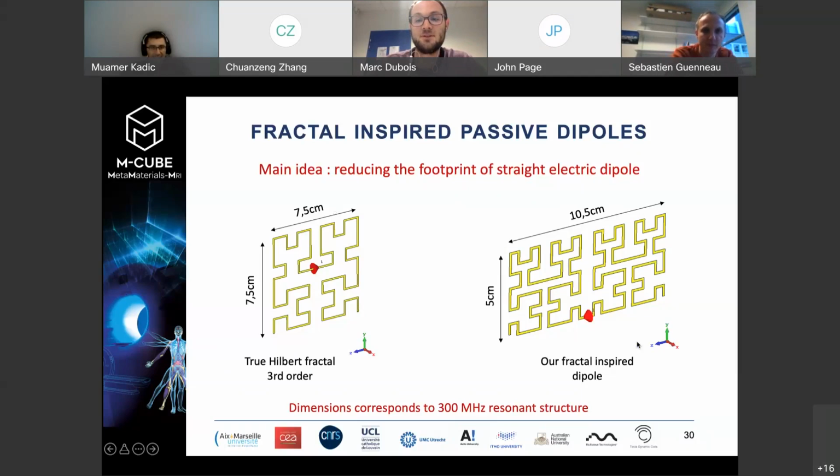Thank you very much. Sebastian, Mark, we have another question in the chat. Yes, I can read it. I understand that the problem is too hard to invert in the sense of a target field approach. For example, I want to concentrate all B1 to a small chosen region of the FOV.